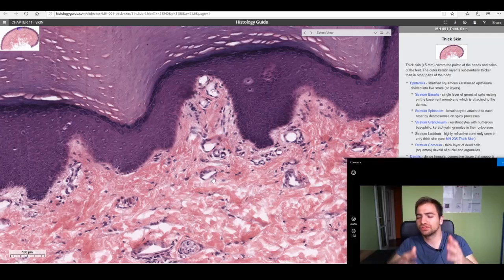So in this area, we simply see the loose density of the connective tissue. Don't be confused. In all cases, the terms loose and dense simply refer to the density of collagen fibers in the area that we're examining. So the distinction is not necessarily always 100% clear. We'll find areas that are more loosely dense, some looser, and some areas of way higher density. So it's not necessarily 100% accurate to term one connective tissue loose or dense. We simply term it by the tendencies of the density, not the precise densities. This is a pedagogic, an educational classification, not so much a functional one.